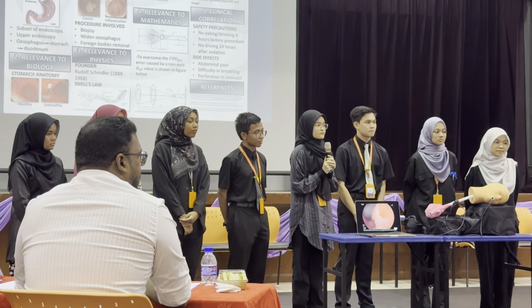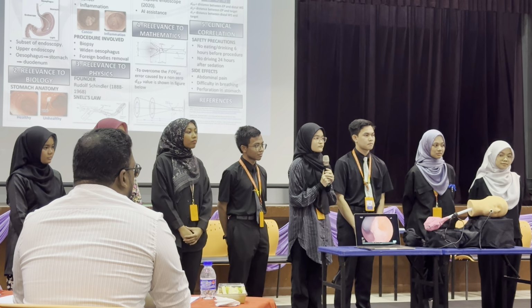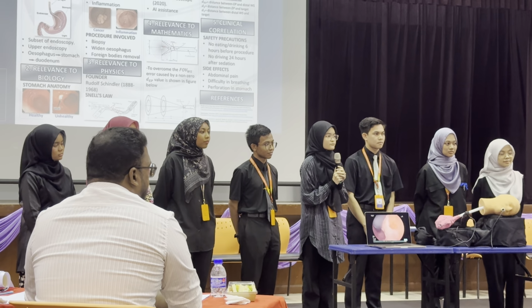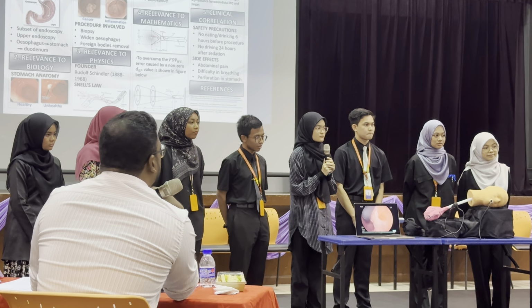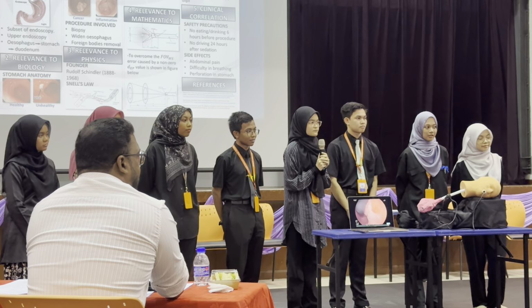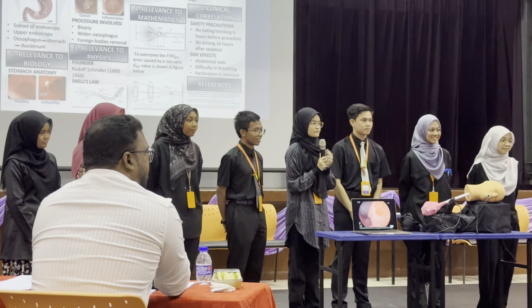Since the advent of fiberglass, we now have flexible ones, because they don't have any mirror. It is only the fiberglass which is reflecting the light, and by the reflection of the light it brings the view of the organs inside. Okay, that is just for your information. Capsule endoscopy is entirely different.